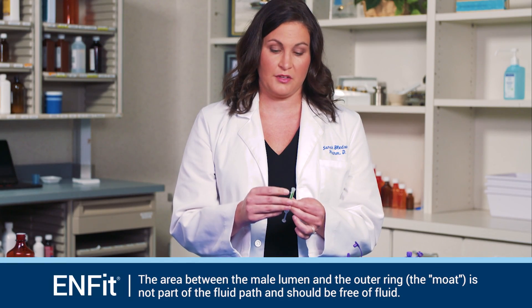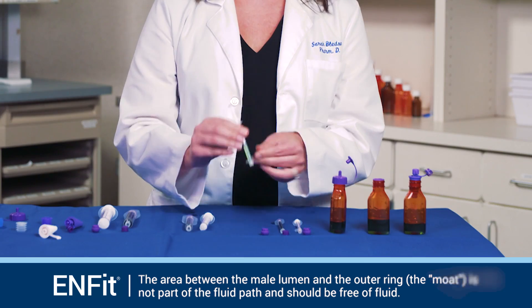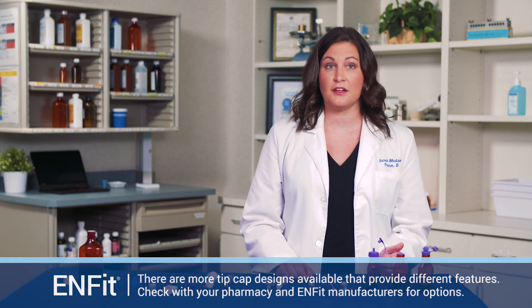Check to make sure there is no fluid in the tip of the syringe. At this point, your medication dose is ready to be capped. We're going to repeat this again with another fill cap and a different type of syringe to demonstrate the procedure.